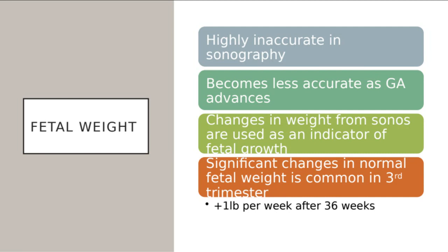Sometimes if we have a physician who is relying on ultrasounds for fetal weight for whatever reason, we are going to be doing serial ultrasounds for that. So probably about once a week, we'll be doing some sort of growth scan just to see what that fetal weight is doing. Now, there are some reasons why we should be doing serial growth exams for questions of estimated fetal weight, and those are really going to be in cases of gestational diabetes or diabetes mellitus.